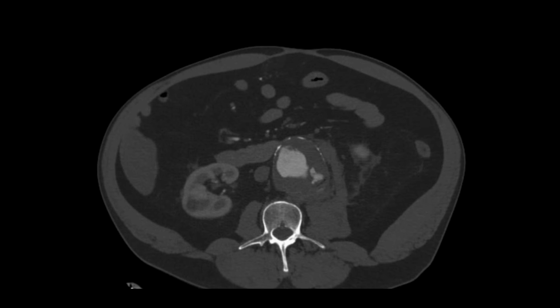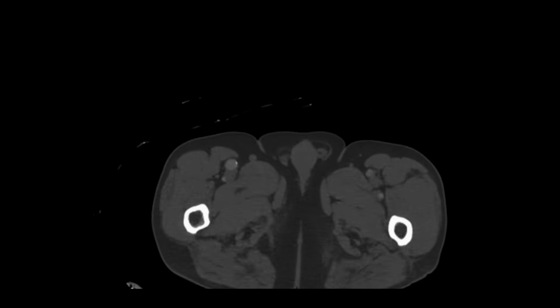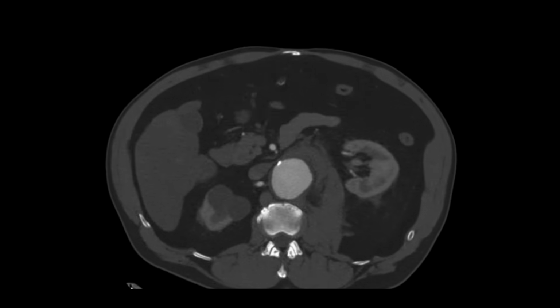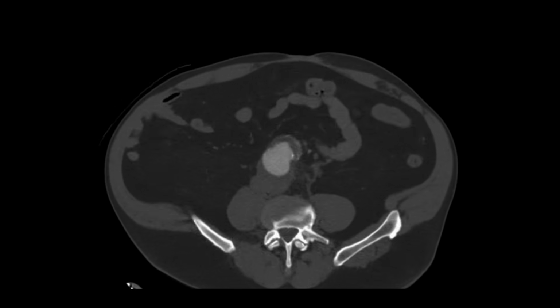Have a plan in your back pocket for this moment. Given his advanced CKD at baseline, we planned for a traditional EVAR device with planned coverage of the bilateral renal arteries, with a bailout plan to snorkel the mesenteric vessel if we could not achieve a seal proximally.